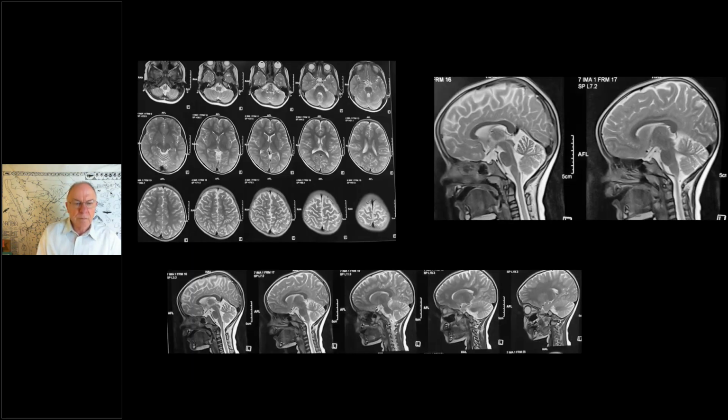So this is another proven case which we have, and on the images you can appreciate some degree of volume loss in the superficial frontoparietal regions. The deep gray nuclei demonstrate normal appearance, but the main finding is in the cerebellar parenchyma: the vermis and the cerebellar hemispheres demonstrate isolated cerebellar atrophy. Brainstem is normal. As discussed in our previous case, the finding is not specific, but since we had a confirmed diagnosis, I just wanted to show this case.